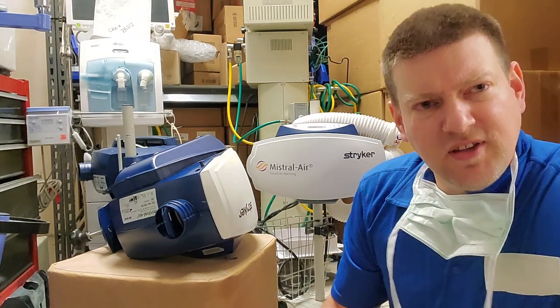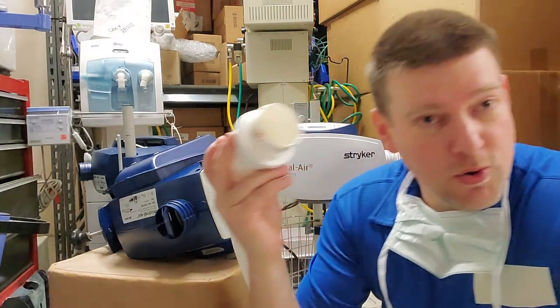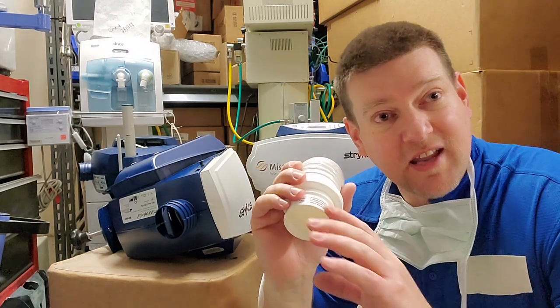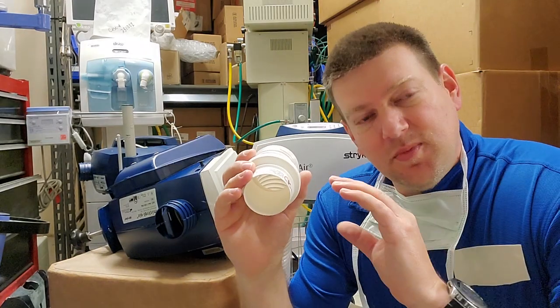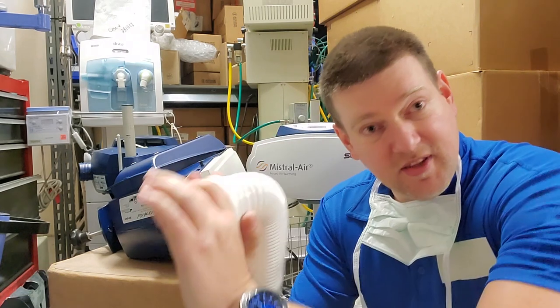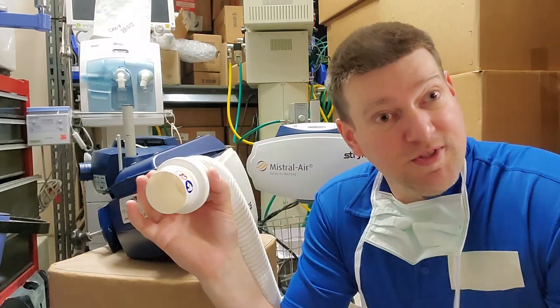We have a hose which extends to the patient where there is a consumable blanket. Think of it like a trash bag — this trash bag has reservoirs and chambers, and as you plug it in it will inflate those chambers and it forms a thermal blanket.